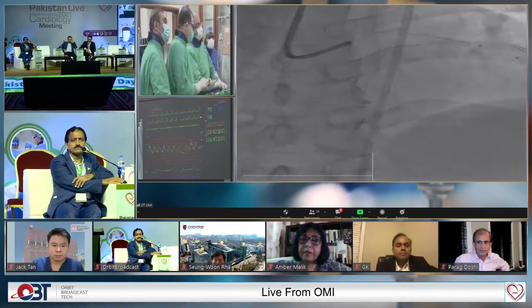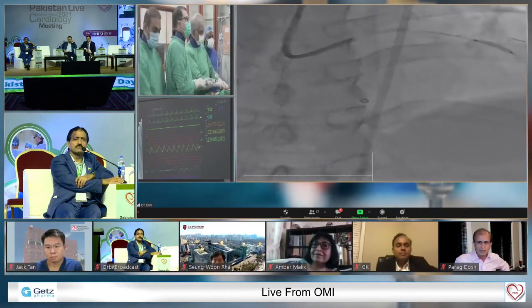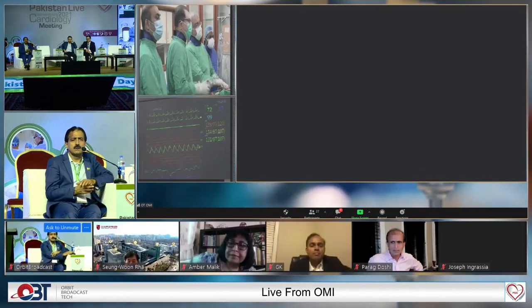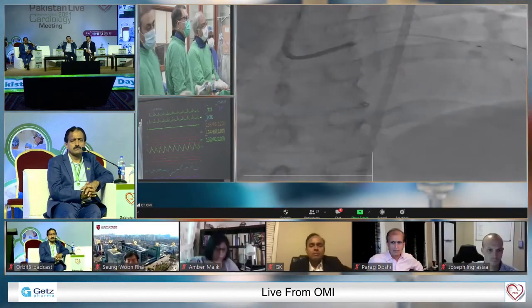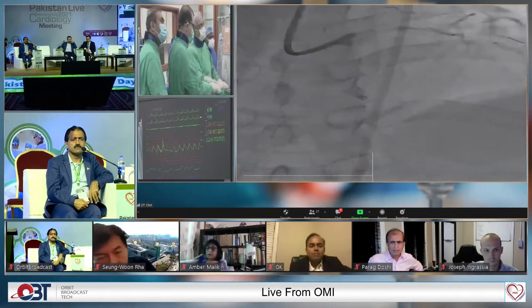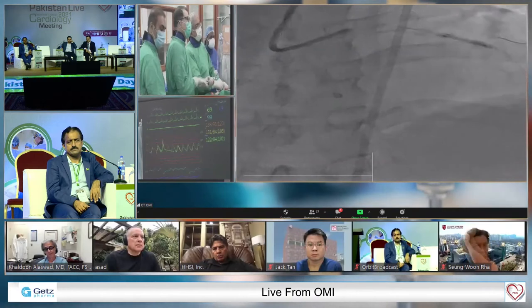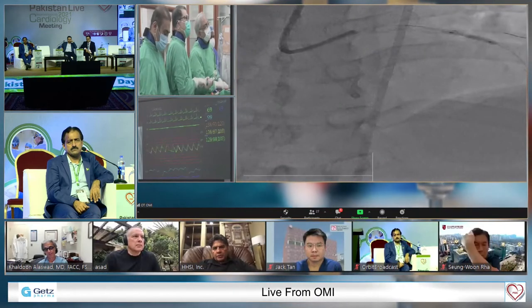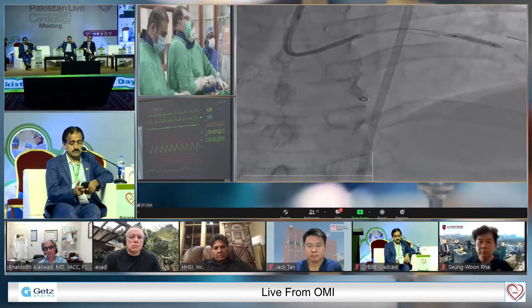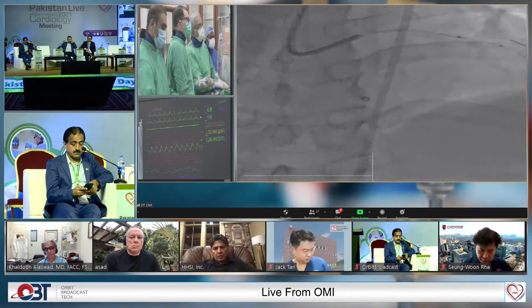Sorry. Sohail? My thought. Yeah, sure, go ahead. His name is Dr. Doshi. If you looked at the initial pictures, you could see some dye hanging out there in the proximal cap. I think it's more of a recent CTO, and with a Fine Cross there, or a Turnpike, or Corsair, a regular polymer jacketed wire should go through. I've gone to using Mongo a lot more instead of the Pilot. I find it's a little heavier and works a little bit better, and we can form the knuckle pretty easily.